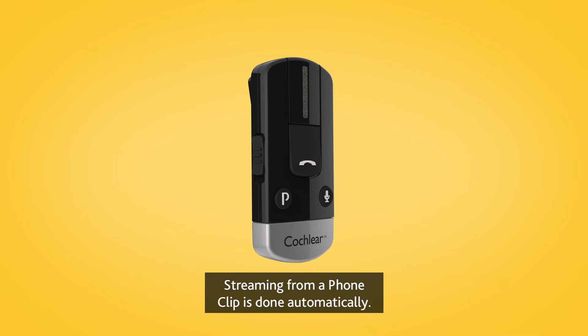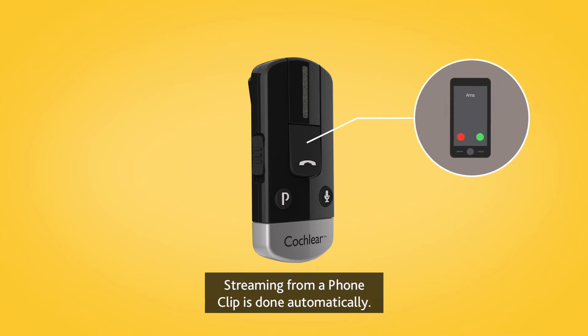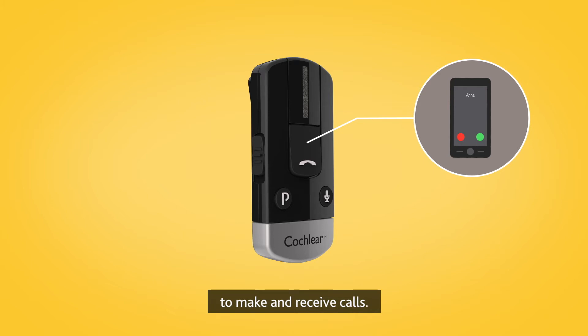Streaming from a phone clip is done automatically. Just use the controls on the phone clip to make and receive calls.